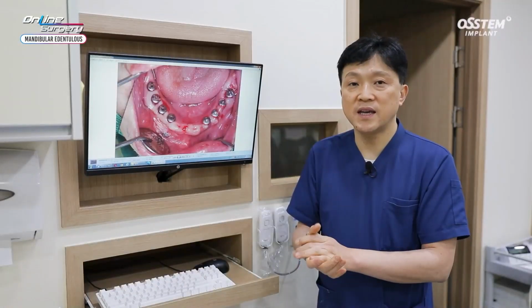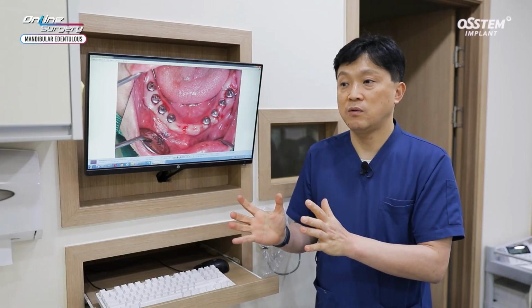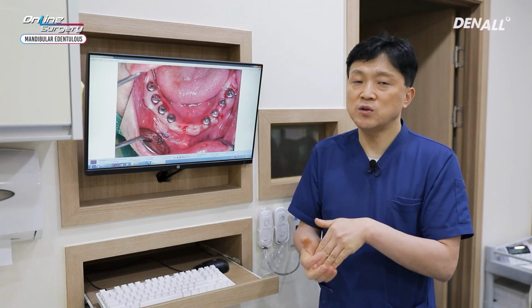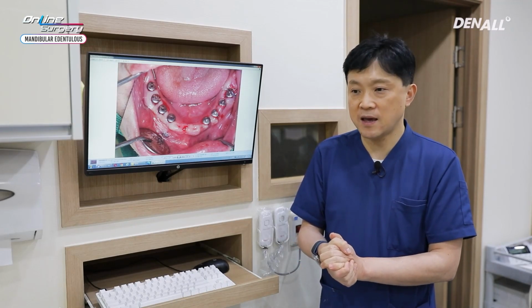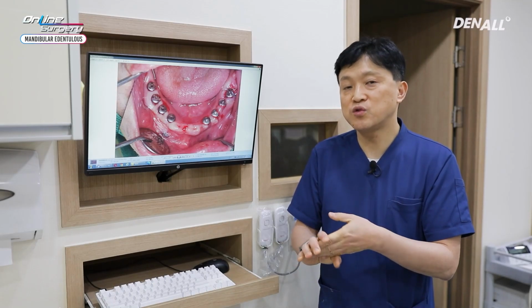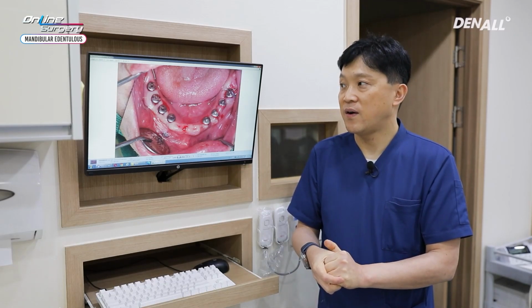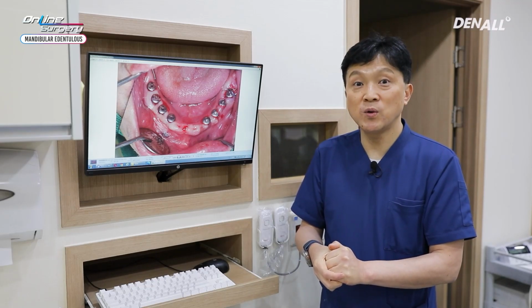Second, OneGuide drill has excellent cutting power and you can do full depth drilling from the start, but I believe it is better to do it 3 times in an incremental fashion. Then you can prevent bone being cut without irrigation. This is the end of the surgical clip.